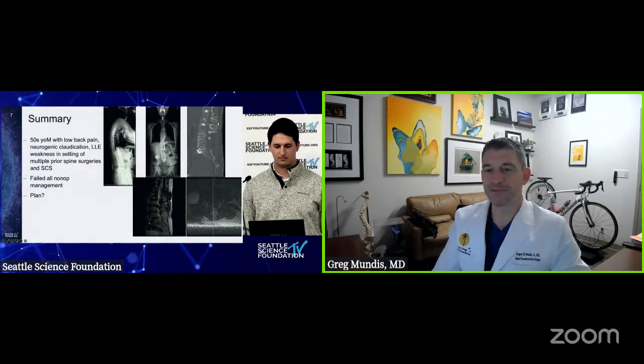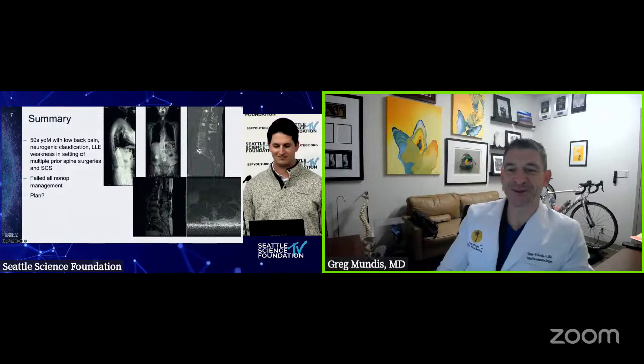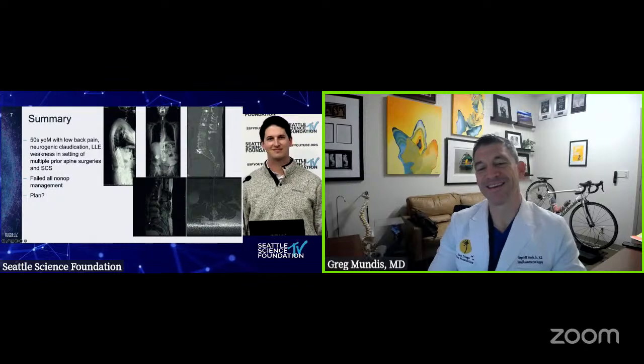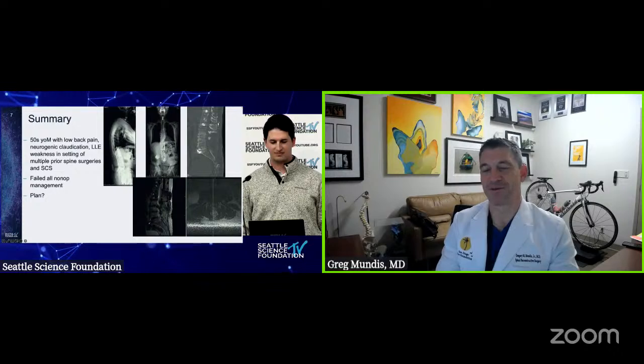Yeah, well, I think he's rapidly losing that battle. If you look at, thanks for throwing the CT up there, that just shows you, I don't think this is much of a salvage place anymore.